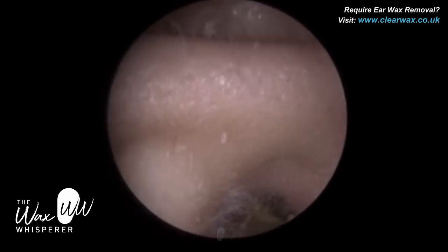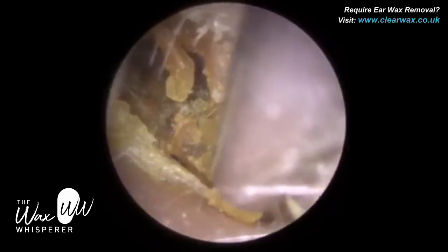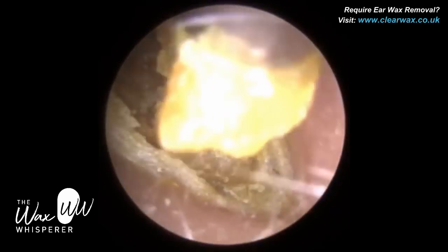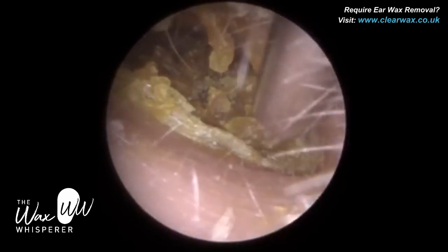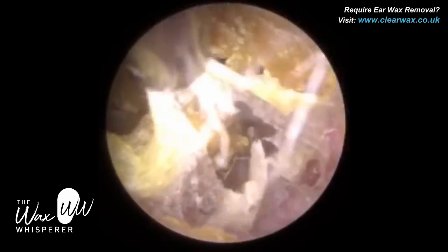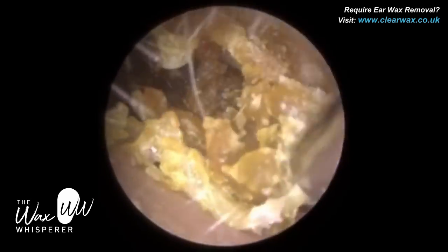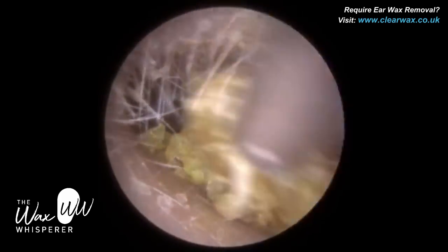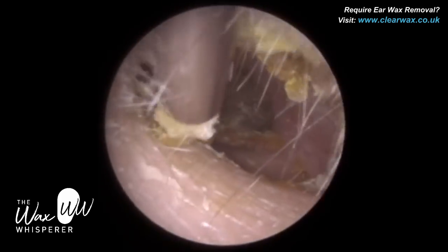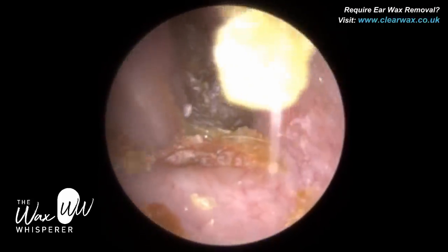About a decade ago, the use of head loops became quite common in earwax removal, at least in the UK private sector. Head loops are slightly different to a microscope — they are essentially magnifying glasses for both eyes, but they don't converge the interpupillary distance. So in the case of the ear, unless the patient's ear canal is very wide and the wax is very lateral near the entrance, you would struggle for depth perception using traditional head loops, because both eyes can't see deep inside the ear.